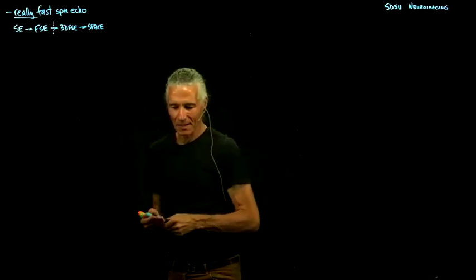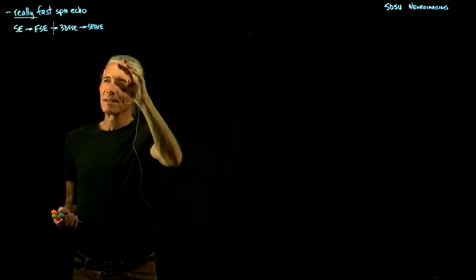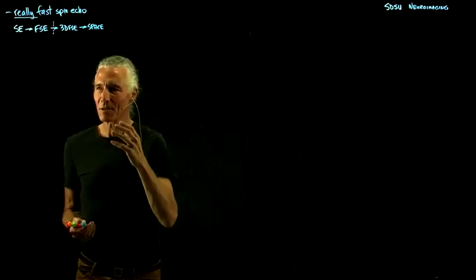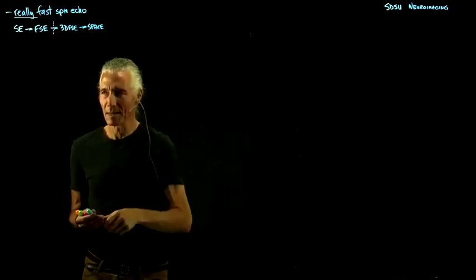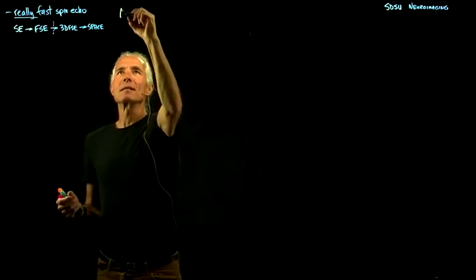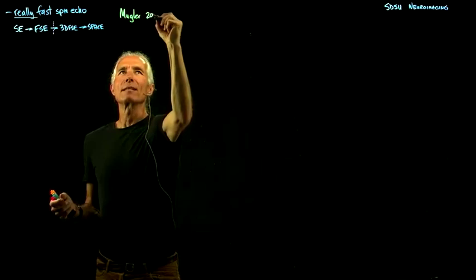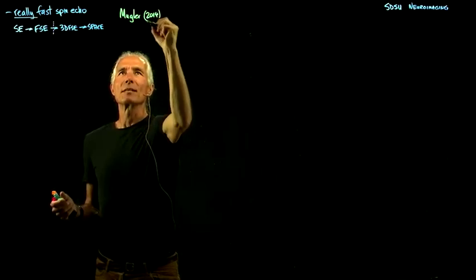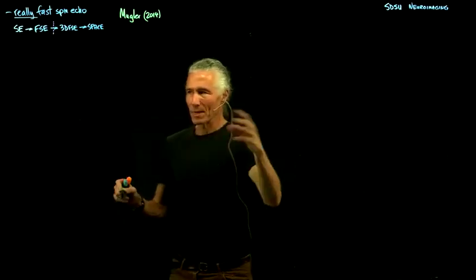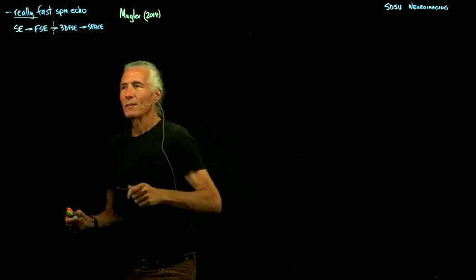So I'm going to put 4 different ways of fiddling with the flip angle and how much signal you get out, to go over how they developed the sequence. And if you want to read about this, there's a paper by Mugler. You can look at what I'm going to go over here.